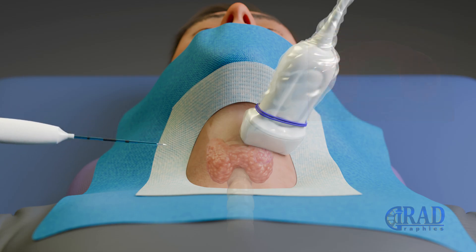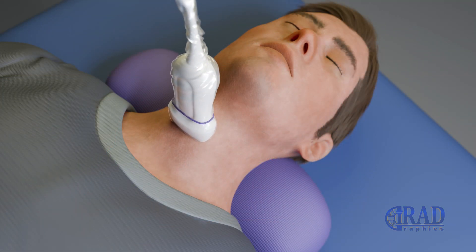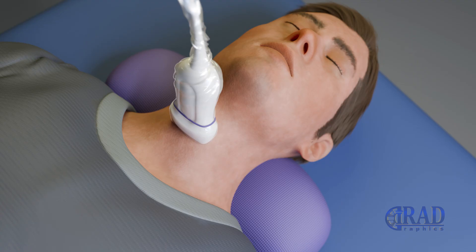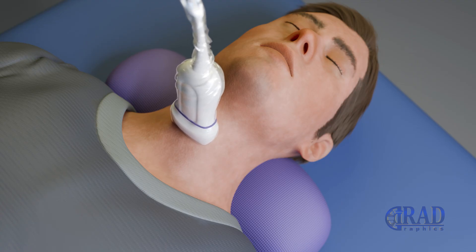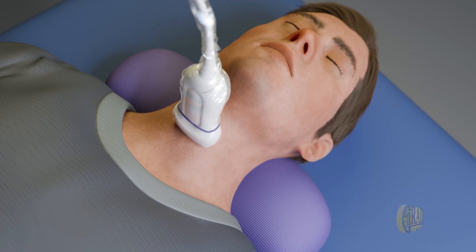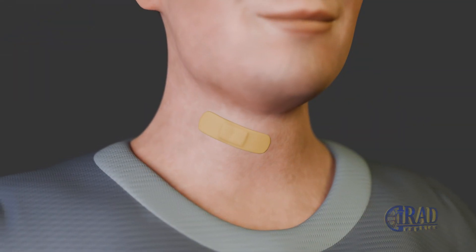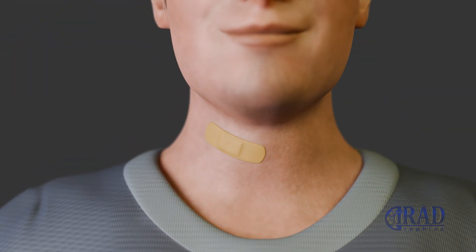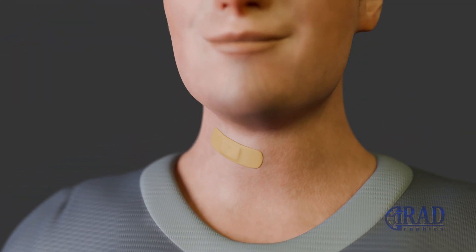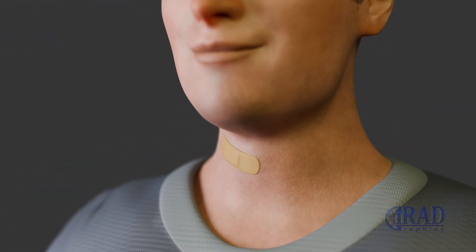When the ablation is complete, the neck is re-examined with ultrasound for any immediate issues such as bleeding or a small hematoma. A small bandage is applied at the entry site, and the patient is observed briefly before going home the same day.